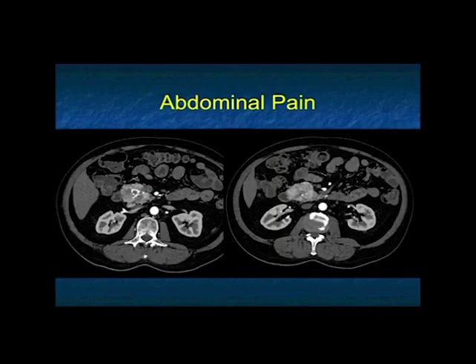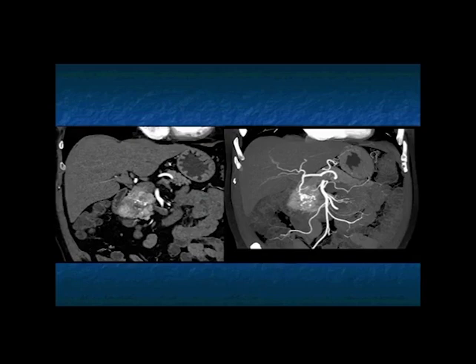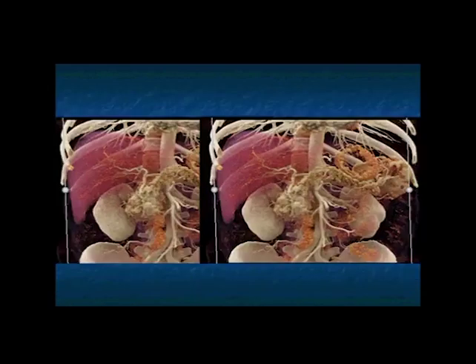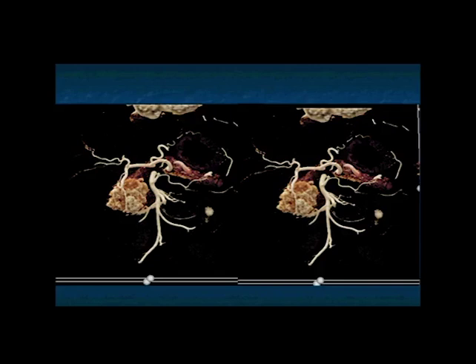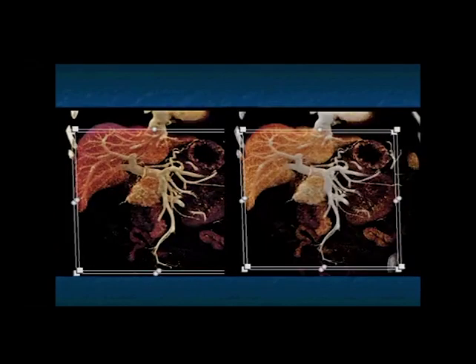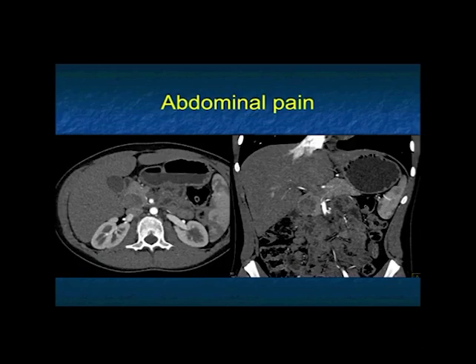Another patient with abdominal pain: a vascular lesion, kind of looks like serous in terms of vascularity, but the calcifications push you more toward a neuroendocrine tumor. Serous cystadenomas usually have little dots of calcification — this is coarse calcification. This is a neuroendocrine tumor with coarse calcifications, very nicely shown with washout on venous phase. You can see the lobulations, the tumor in the pancreatic head, and the prominent vascularity. The mass pushes against the patient's portal vein and SMV, but no invasion is seen in this well-differentiated neuroendocrine tumor.